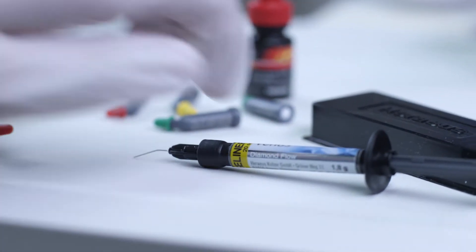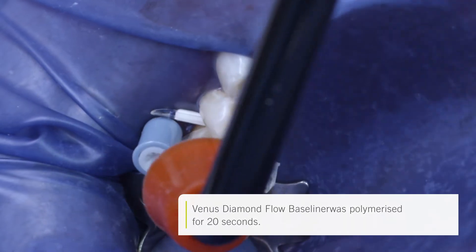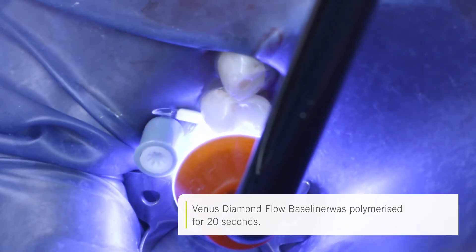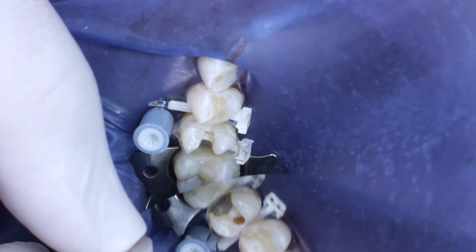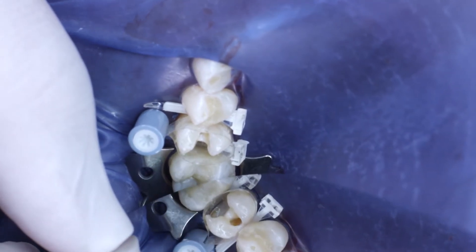I then applied Venus Diamond Flow in Shade Baseliner to the floor of the cavity. The advantage of Venus Diamond Flow Baseliner is that it can be very clearly distinguished from the residual tooth structure thanks to its opacity and white color. Particularly if a re-entry is required, the floor of the cavity can be clearly distinguished so that healthy tooth structures do not need to be removed unnecessarily.